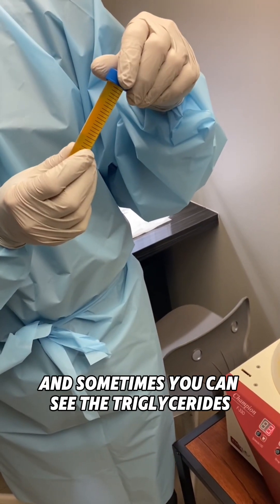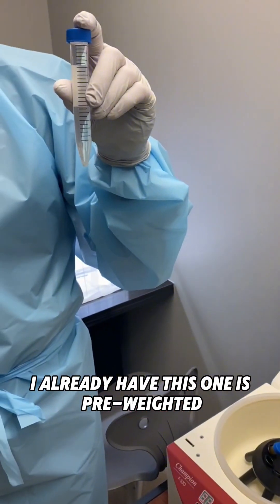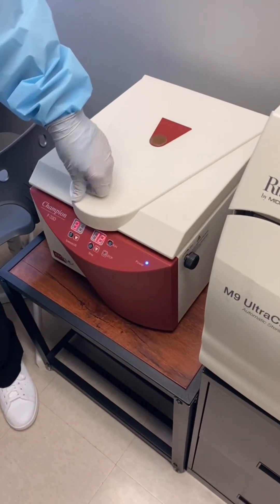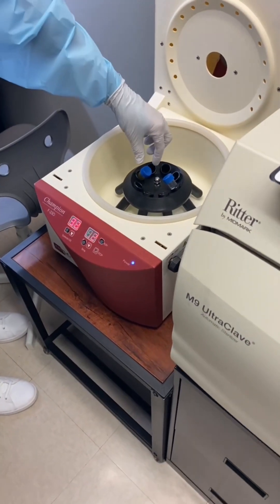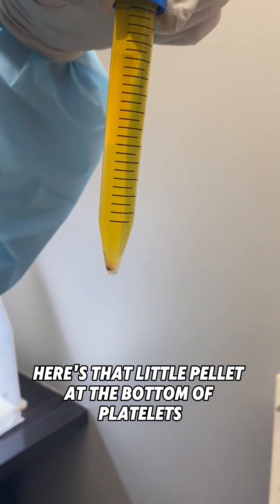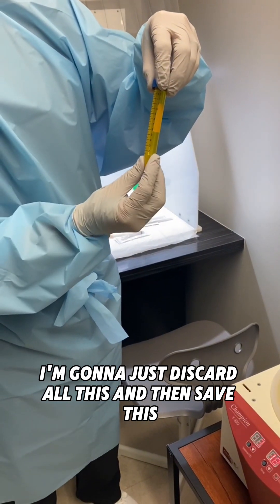Sometimes you even see the triglycerides — that's not good. This one is looking good. This one is a bit heavy so I counterbalance it. This is the hard spin, step two. You use that little pellet at the bottom of platelets.